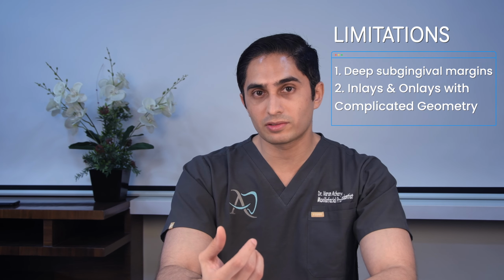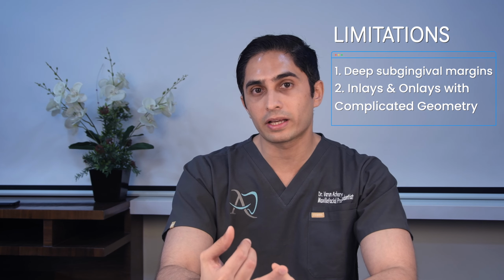We spoke about some of the limitations, at least according to me: deep subgingival margins, inlays and onlays with complicated geometry. But what about implant dentistry? In terms of my comfort levels with implant dentistry and intraoral scanning, I would say I'm not quite there yet. I've tried using an intraoral scanner for many cases with single units or maybe a 3-unit bridge with implants, and somehow what never ends up coming out just perfect are the contacts. I always feel the contacts are either wide open or they are too tight, and those require a little bit of adjustment. The occlusion is usually spot on, but the contacts always seem to have some kind of issue.